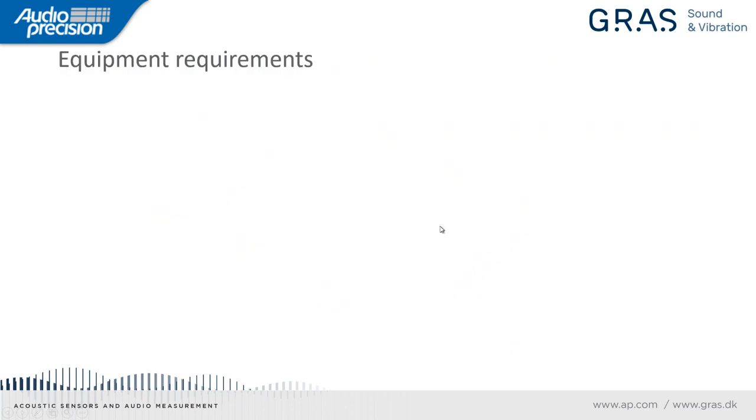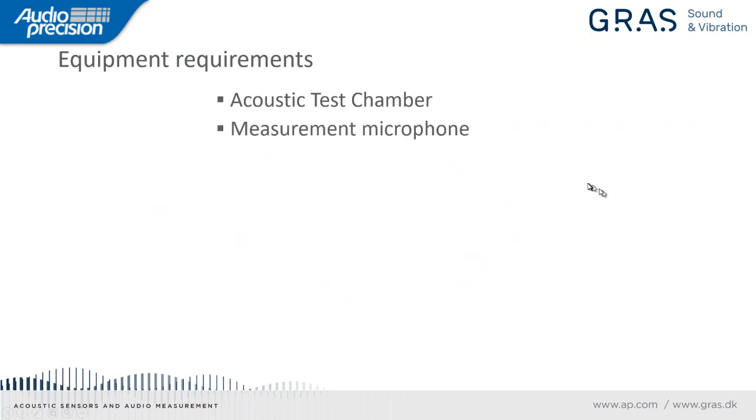All right, so let's talk about the equipment requirements a little bit. First of all, we need an acoustic test chamber or a test box. This isolates the measurement from the ambient noise. It also has a built-in loudspeaker, in some cases a loop to test the telecoil, and it can convey the power to the hearing aid. We also need a measurement microphone. This is very important, of course. A 2cc coupler. So this is specified by both of the production test standards. And for the R&D standard, the Part 0, you have the option of using an ear simulator if you prefer.